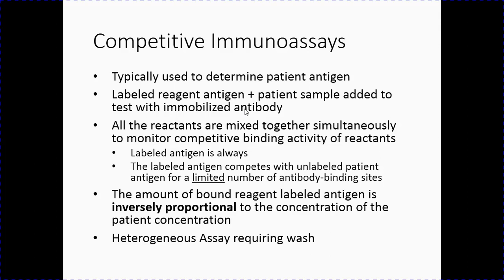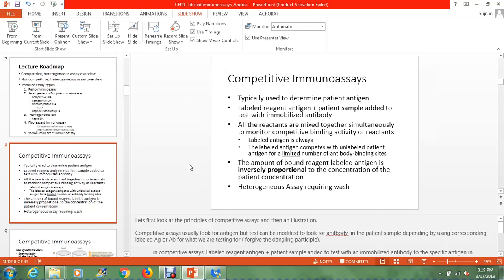Labeled antigen is always in excess. This should say "in excess" right here. I'm going to put it here just so you have the same thing when you get your notes. Always in excess.